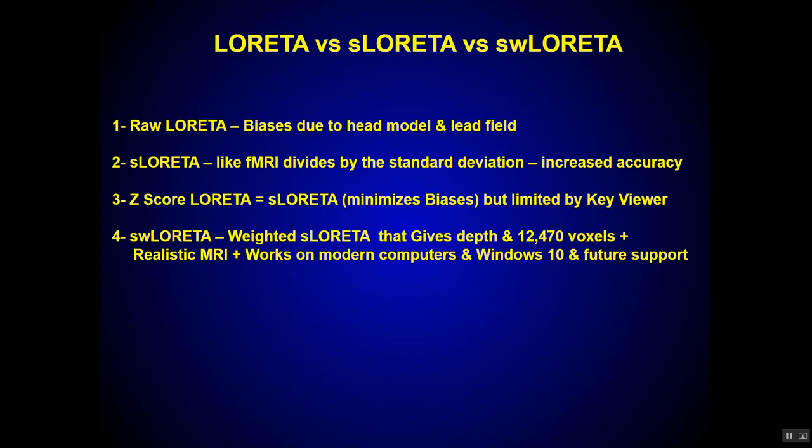So he has a transform matrix that takes all the voxels, because they're quite heterogeneous. There are different tissues inside the brain, and by using a transfer matrix to make it homogeneous, he gets better resolution in the depth.